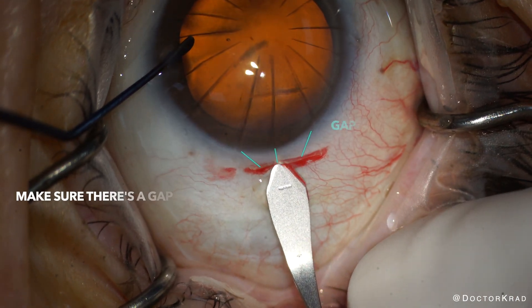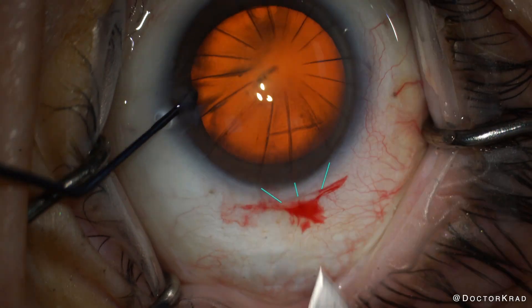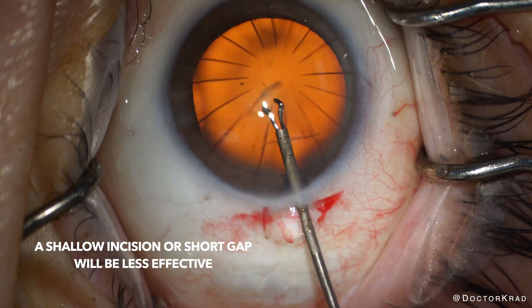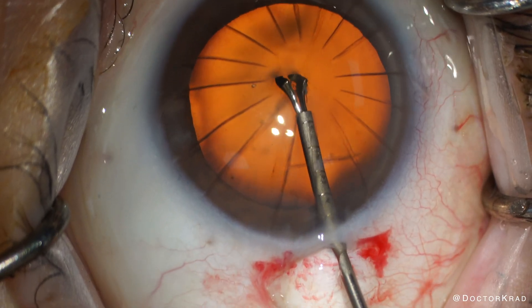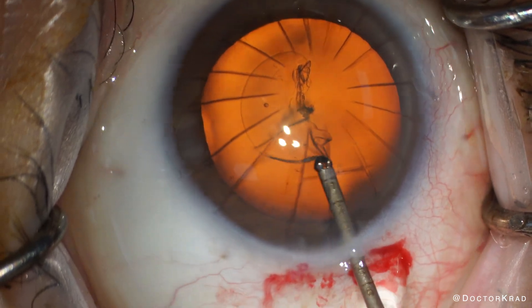Then I create a tunnel at least a millimeter into the clear cornea. Be sure to enter the sclera at your scleral groove. You need a gap of tissue in between where you enter the sclera and where the RK cuts start at the limbus. If your incision is too shallow or the gap is too short, the chance of your incision tearing radially into the previous RK cuts increases.